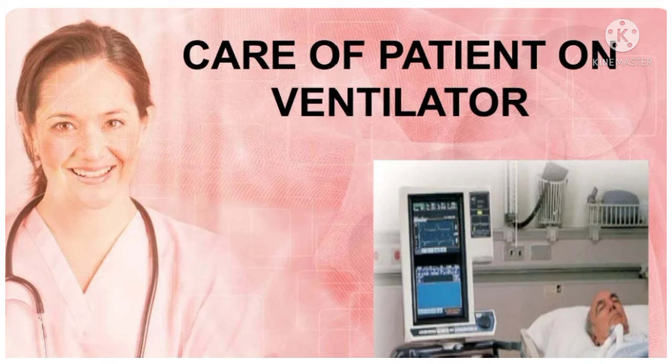Role of other team members. The respiratory therapist auscultates breath sounds and respiratory effort, assessing for decreased ventilation or adventitious sounds. Monitor ventilator settings and alarms. Change ventilator settings as needed or ordered. Maintain appropriate cuff inflation on the ET tube. Determine need for ET tube suctioning and suction patients as needed. Reposition and secure the ET tube based on agency policy. Monitor oxygenation level and signs of respiratory fatigue during the weaning procedure.